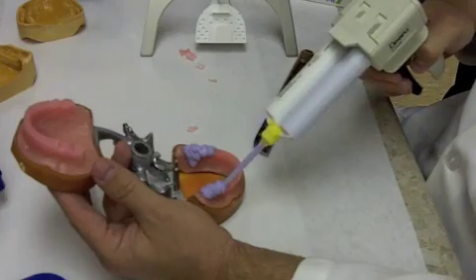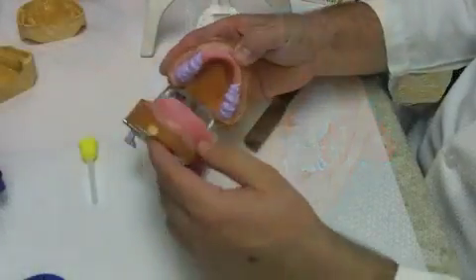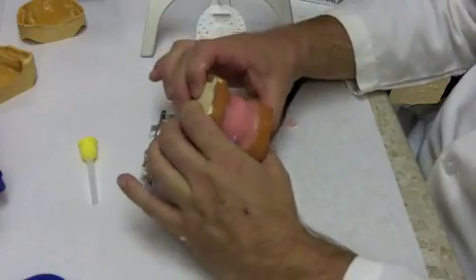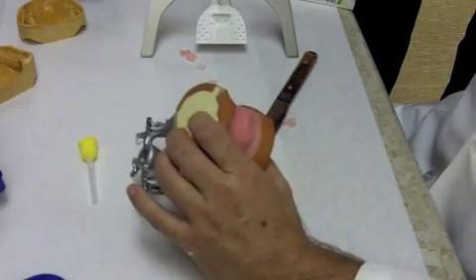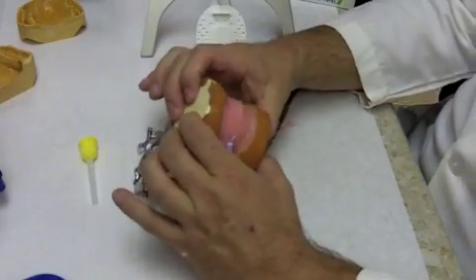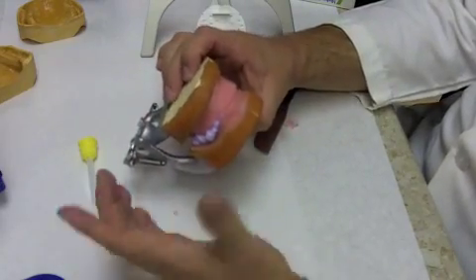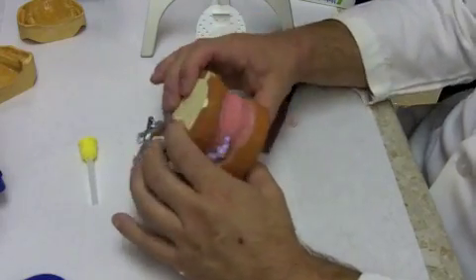of the maxillary denture and have the patient lift their tongue up and touch that. You want your patient to reach their tongue up and touch the back of the denture as far back as they can. And then you're only putting registration material in the area where you created the notch for the registration material. You want to allow that anterior segment to come together. You want to make sure that you close it all the way. For your simulated project, you want to make sure and double check that you're still maintaining that 60 millimeters.